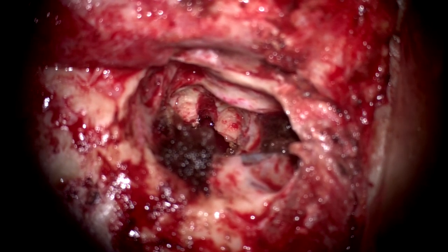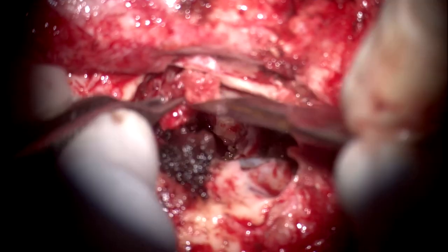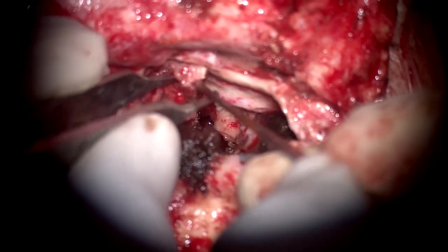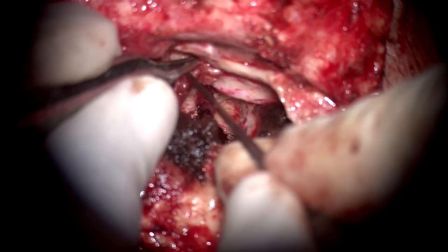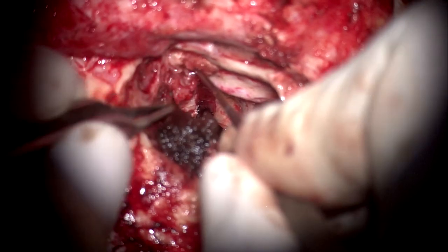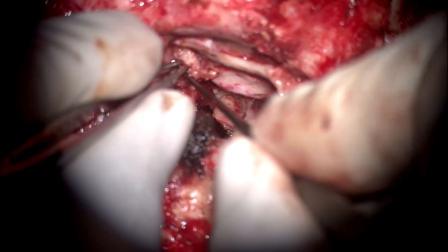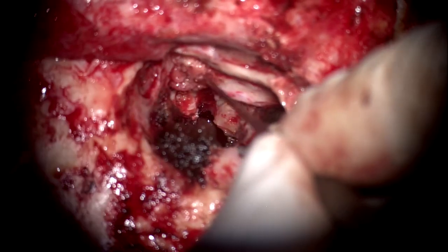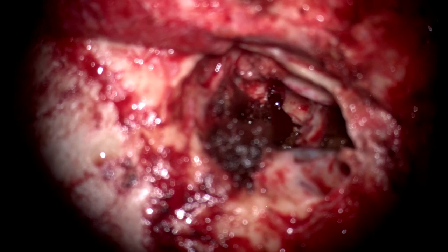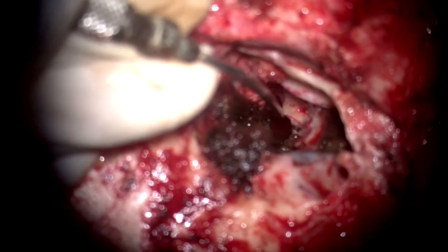With fat, you will be blocking the aditus? Yes, that's what I'm doing now. Not fat, I'll be using muscle there. Did you drill any part of the aditus to make it raw before putting in this plug of muscle? Yes, the initial drilling made it raw. Okay. And we are passing from this side. The rest, fat will take care of. Do you have glue? See this? Self-holding. Suction. See the good clear fluid inside? Definitely, sir.